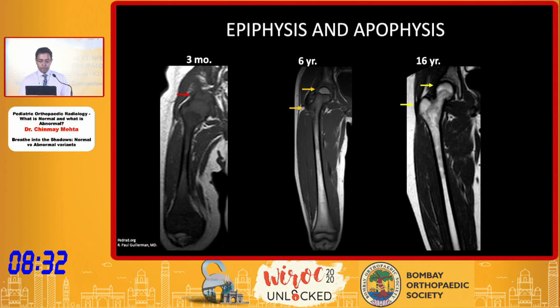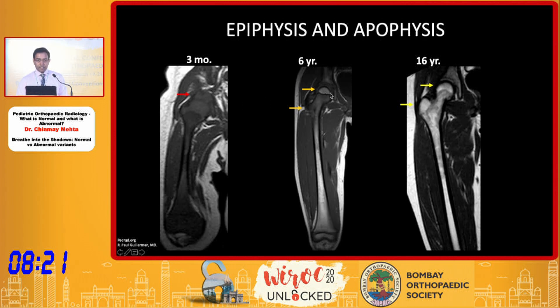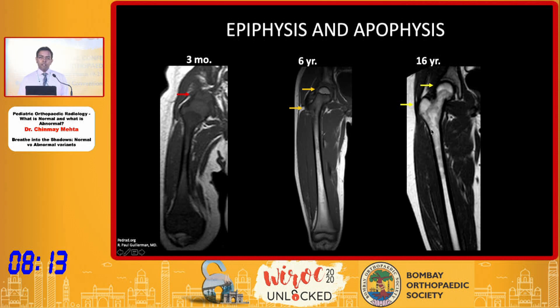Let's look at how the epiphysis evolves as the child grows. At three months of age it is composed of red marrow, so it is isointense to muscle. At six years there is fatty marrow in the epiphysis, so it becomes brighter on T1 images. At 16 years it is fused and the apophysis and epiphysis look similar in intensity to the metaphysis and diaphysis.